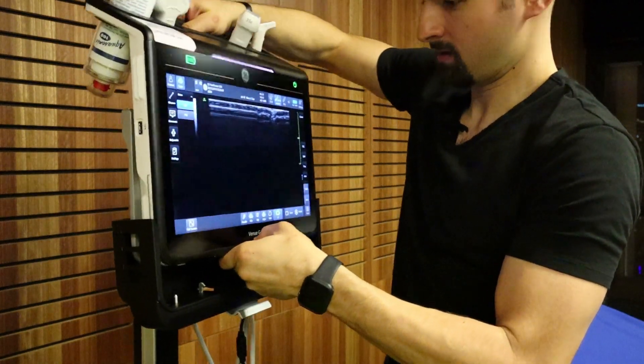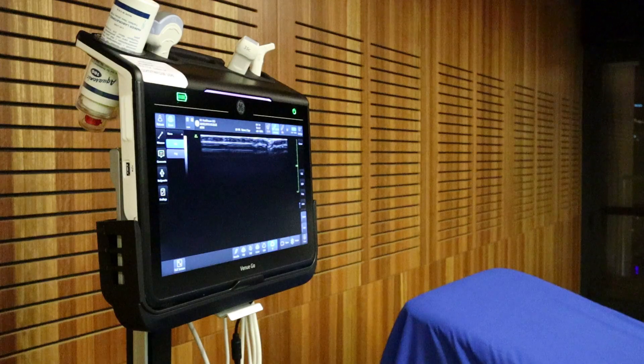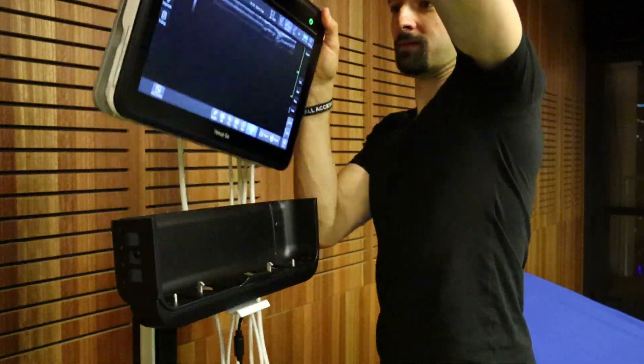Sometimes you're in a crowded room and you don't have space for the whole cart to make it in there, or maybe you're traveling, maybe you're running up to a code. You can just pop this thing off of the cart and take it with you. It's a really easy grip to be able to do this with.